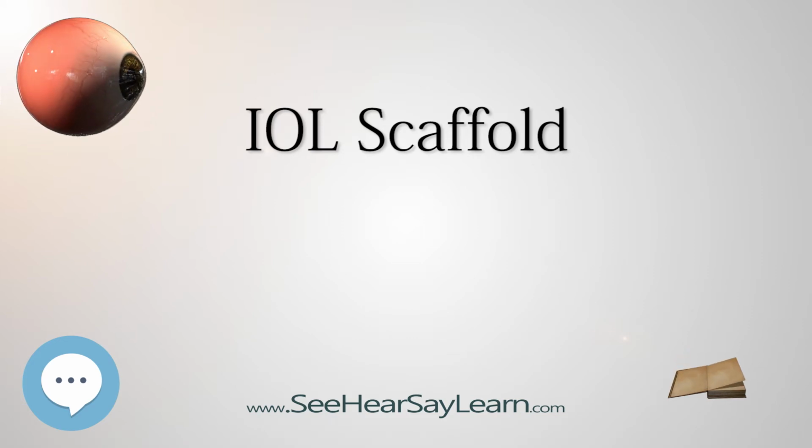3. IOL scaffold for refractive surprise. Refractive surprise can happen in eyes after IOL implantation. Wrong lens or wrong power can be the probable cause for this. In that situation, the existing IOL is removed and another IOL of correct power is placed. IOL scaffold is being used for this condition also, where the new IOL is placed into the lens bag below the old IOL. The new IOL placed acts as scaffold or barrier and helps as a platform for the removal of the old lens.